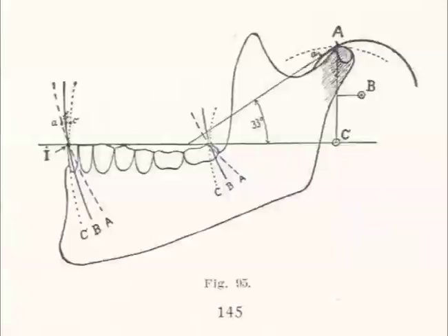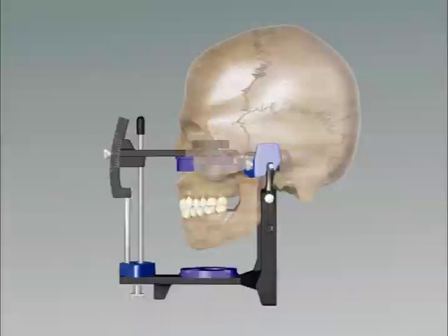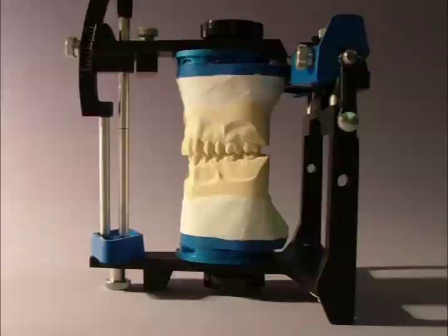The problem arises when you place those restorations in the mouth, the axis of rotation moves up to point A, which creates this downward and backward rotation. And this axis of rotation discrepancy will lead to you adjusting the mesial inclines of the upper teeth and the distal inclines of the lower teeth every single time. So we know we need an articulator that more anatomically represents the axis of the patient. So when we mount the cast in the articulator, we'll be duplicating the movements more accurately.